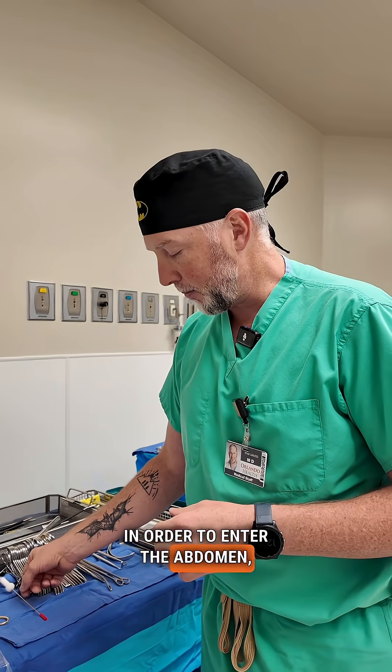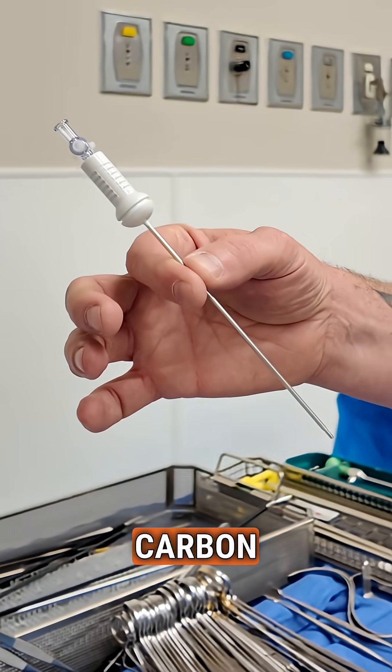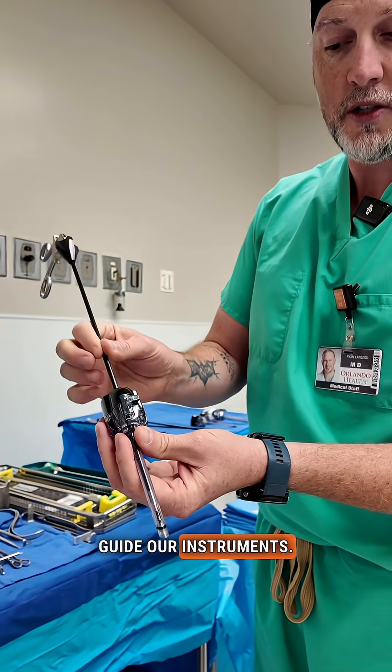In order to enter the abdomen, I typically use something we call the Veress needle. A Veress needle helps me introduce the carbon dioxide gas into the abdomen — that's what creates the big area that I can operate in. We then put ports in order to guide our instruments.